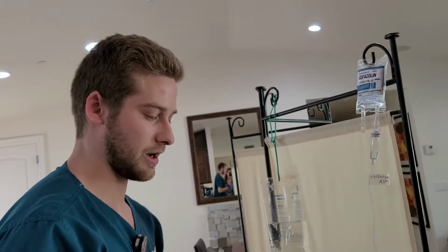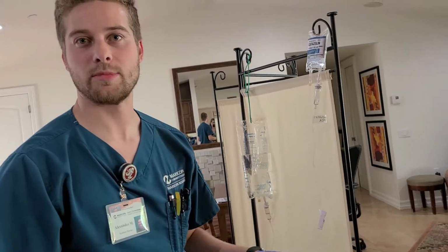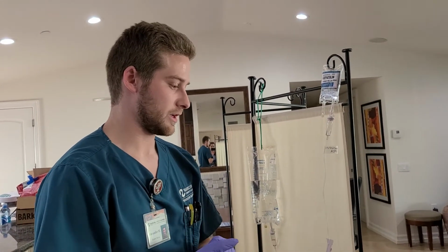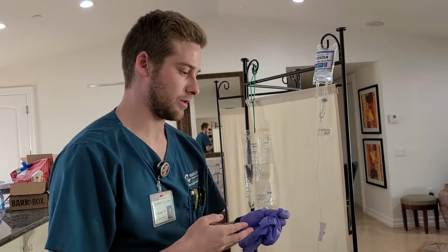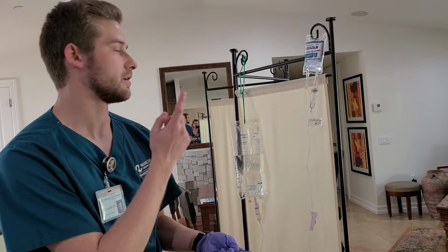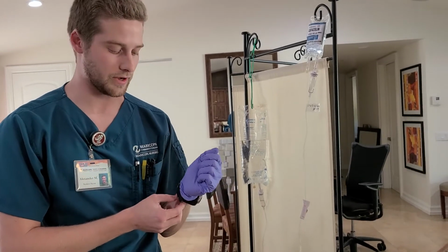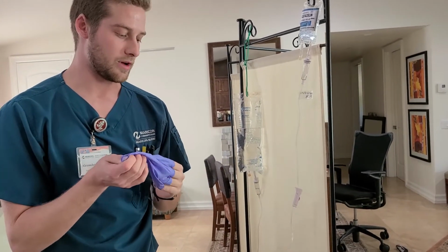So now that we have it hung up at that time, I would check and make sure, are you experiencing any pain at all? No. All right, and with this, I'm going to check back on you in 30 minutes, and then restart your primary line and check on the second, the antibiotic that I gave you for your infection. And do you have any questions at all?